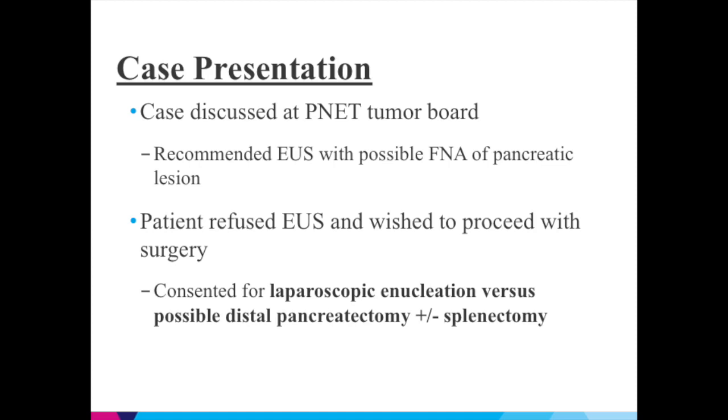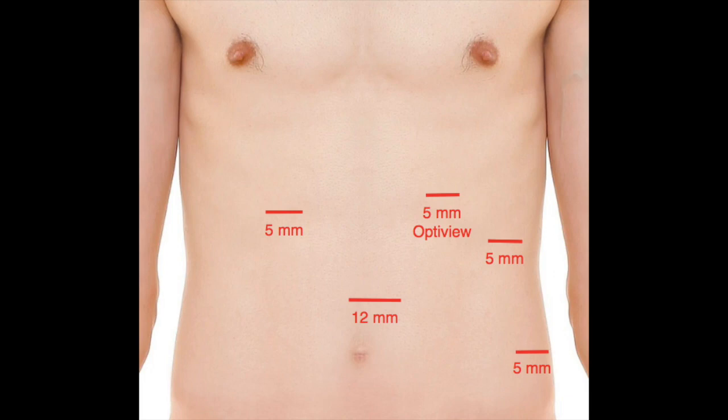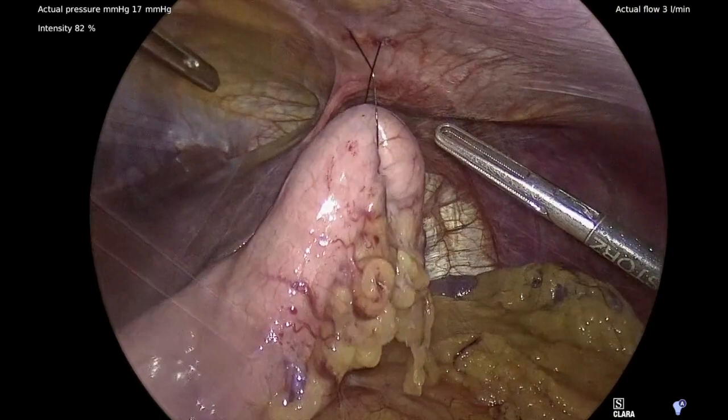Initial access was gained with a 5 mm optical viewing trocar in the left upper quadrant. Additional ports were placed under direct visualization. A general sweep of the abdomen was performed and the gastrocolic ligament was divided with bipolar shears. A transabdominal silk suture is utilized to retract the stomach out of the field of dissection.